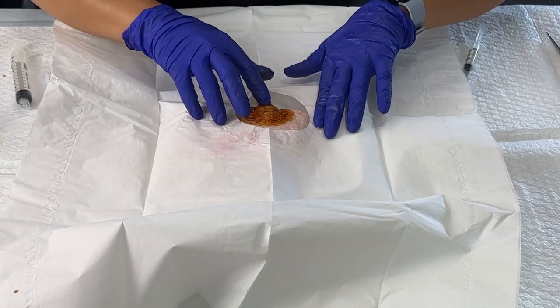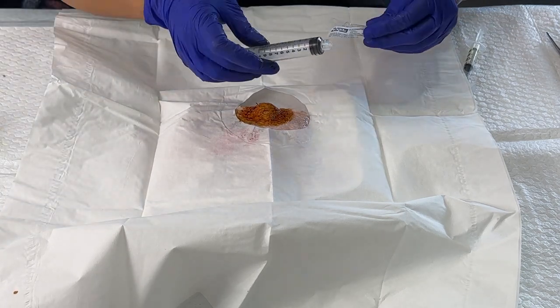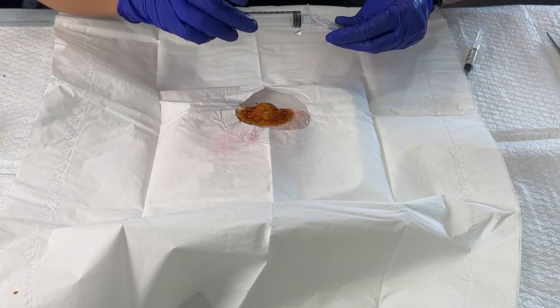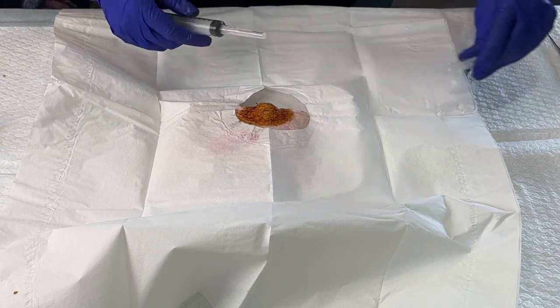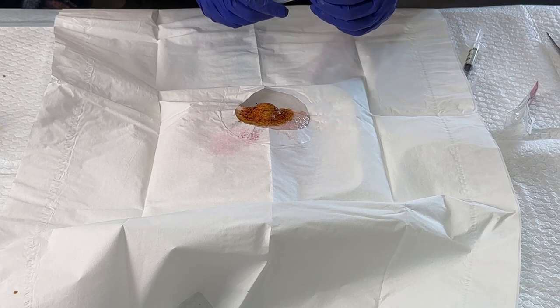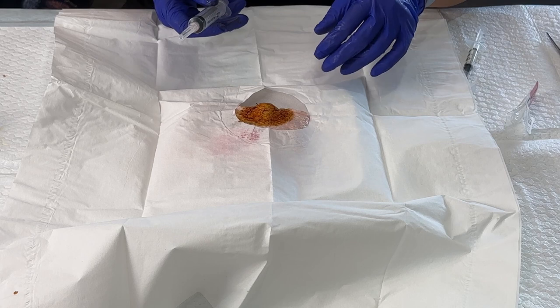I can see that there's the ganglion cyst and I can kind of feel it. I would use either a 5 or 10cc syringe, depending on how big the ganglion cyst is. I'm going to put an 18 gauge needle on it for aspiration because the material within these ganglion cysts is pretty viscous.